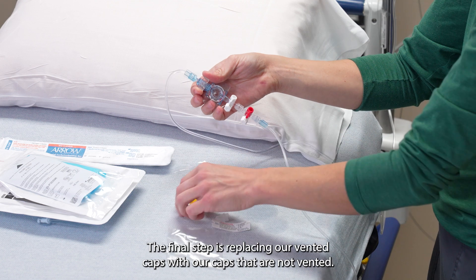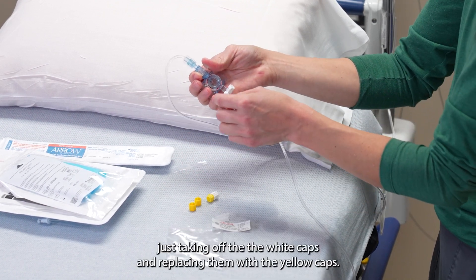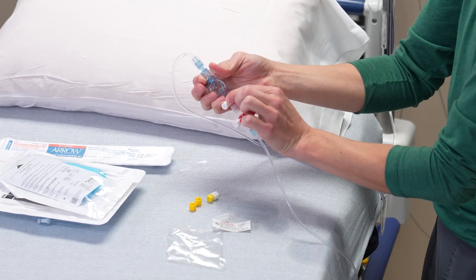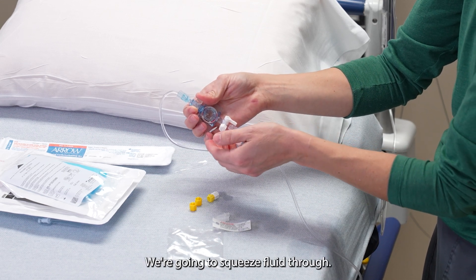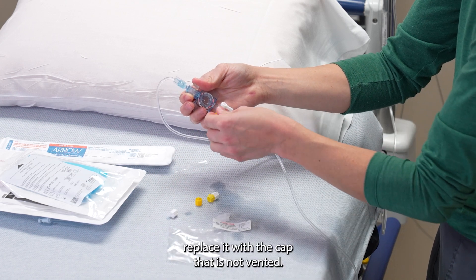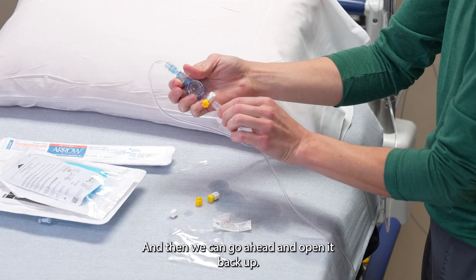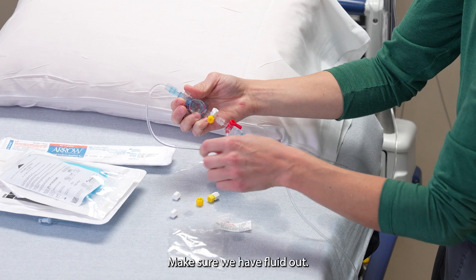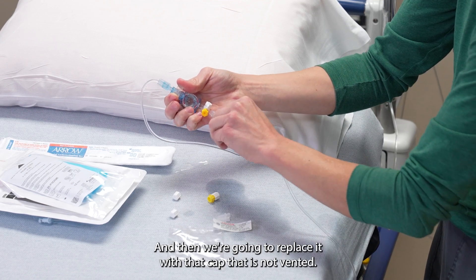The final step is replacing our vented caps with our caps that are not vented — basically taking off the white caps and replacing them with the yellow caps. To do this we're going to turn it off, squeeze fluid through, and then replace it with the cap that is not vented, then open it back up. We're going to do the same thing down here — make sure we have fluid out, and then replace it with that cap that is not vented.